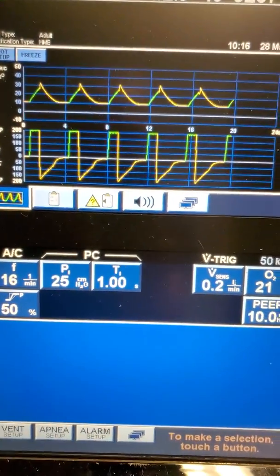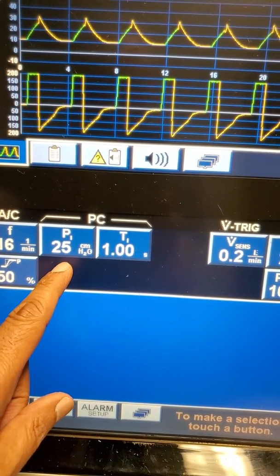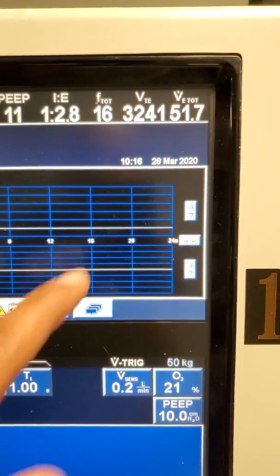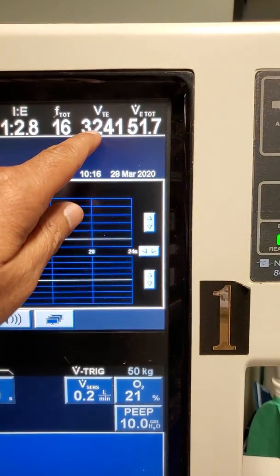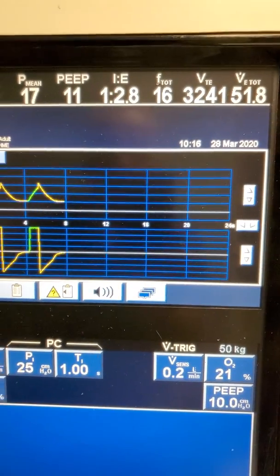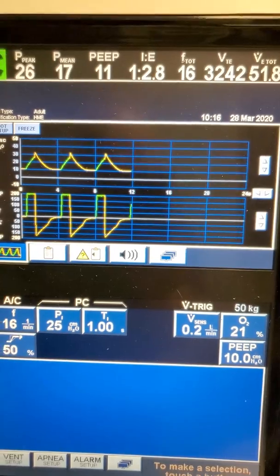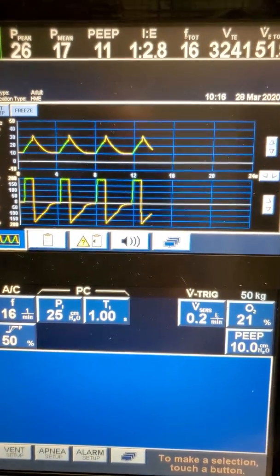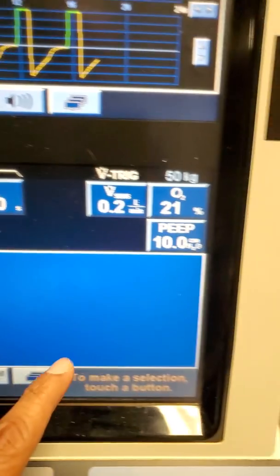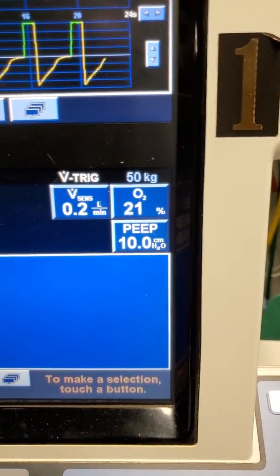This is for the pressure control mode, and the inspiratory pressure we have kept at 25. With the inspiratory pressure of 25, we are getting a tidal volume of 3,241. Now that number scares you, but you have to divide that by 7 and it comes down to 450-something, which is exactly what you would want on these patients. So inspiratory pressure of 25 is what you set up, and then we're obviously using 21% oxygen because we don't want to waste the oxygen in the hospital.